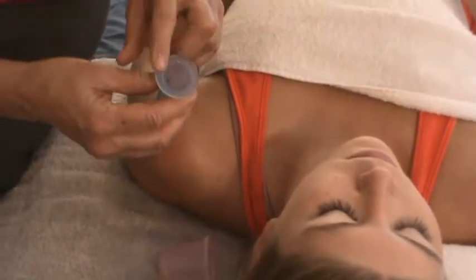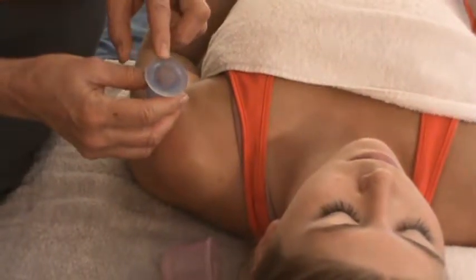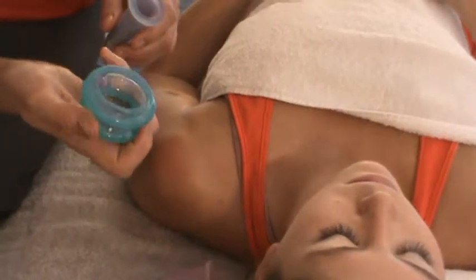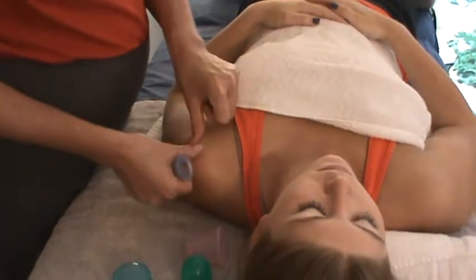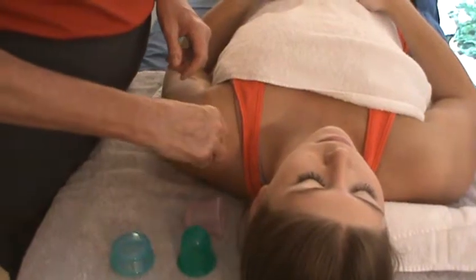I'm choosing a rounded rim cup so that I have nice glide. I've also lubricated the edge of the cup. And these smaller cups have a more gentle suction than the larger cups, or the even larger rim cups here, to get a more deep suction effect. Remember that cupping therapy is a negative pressure, as opposed to the typical positive pressure of pushing into the tissue. The cups are going to be a negative pressure of pulling out.